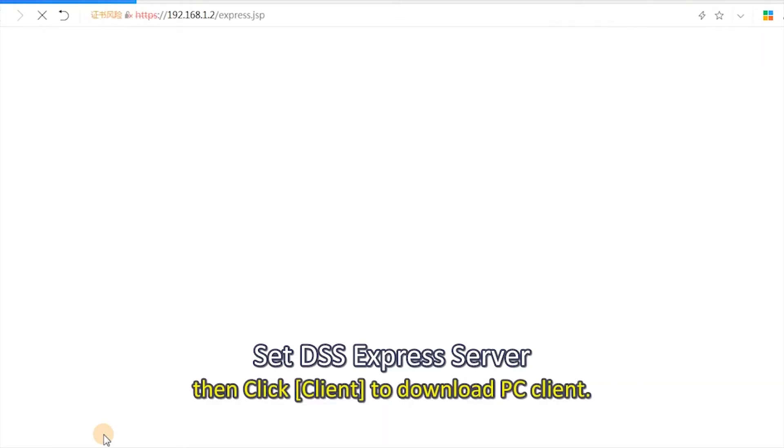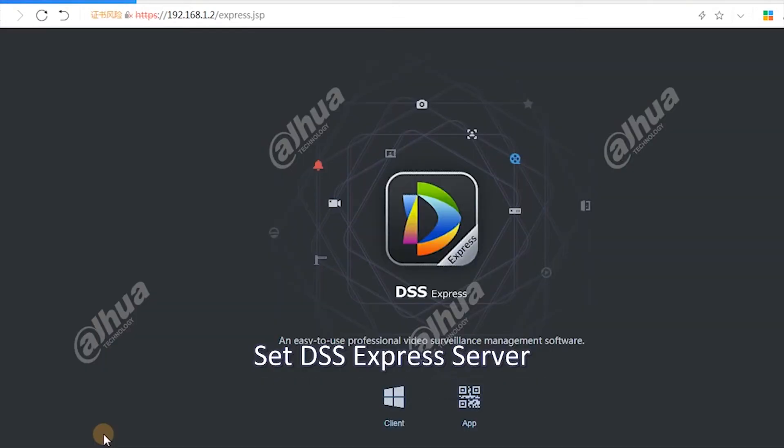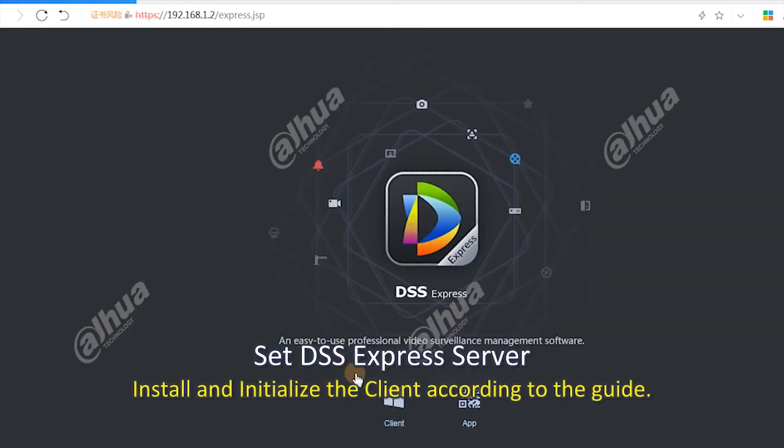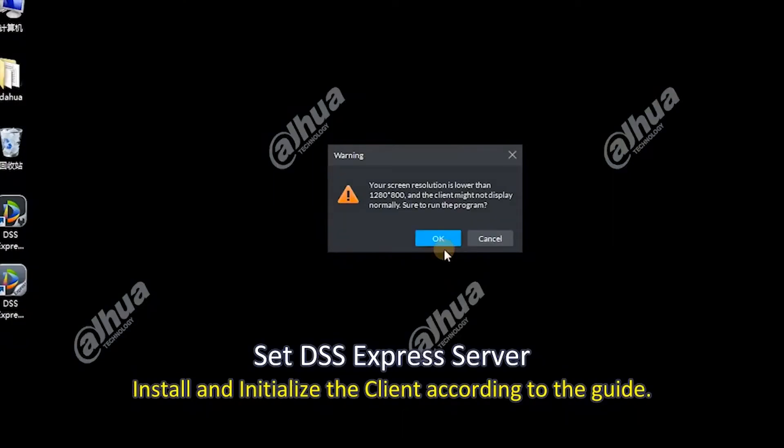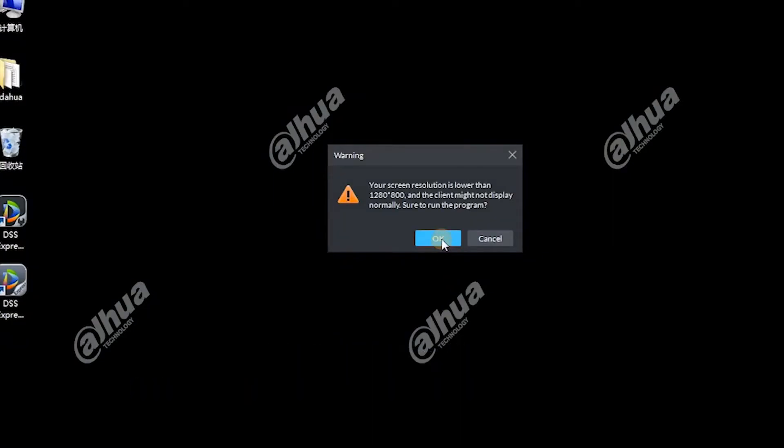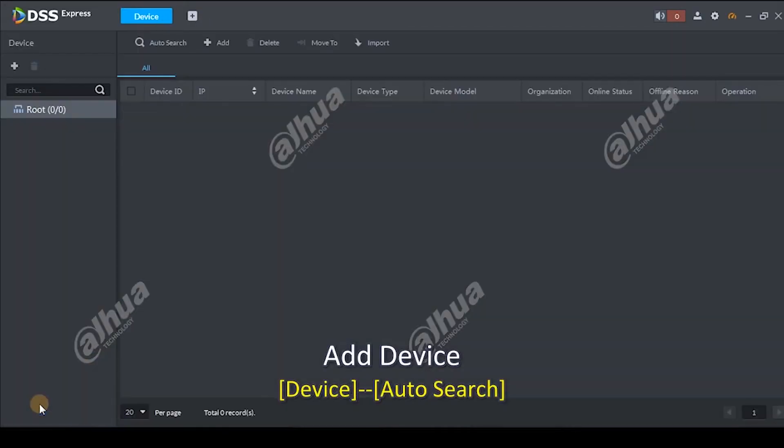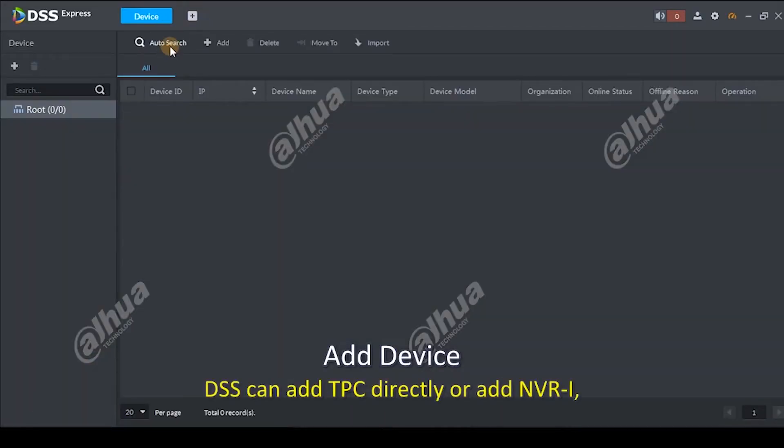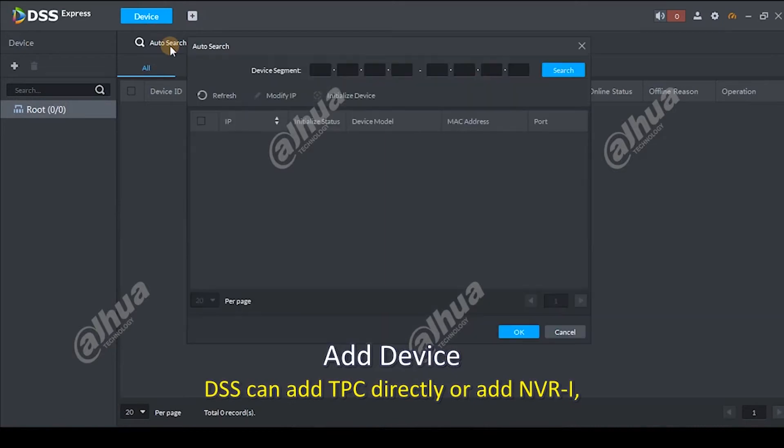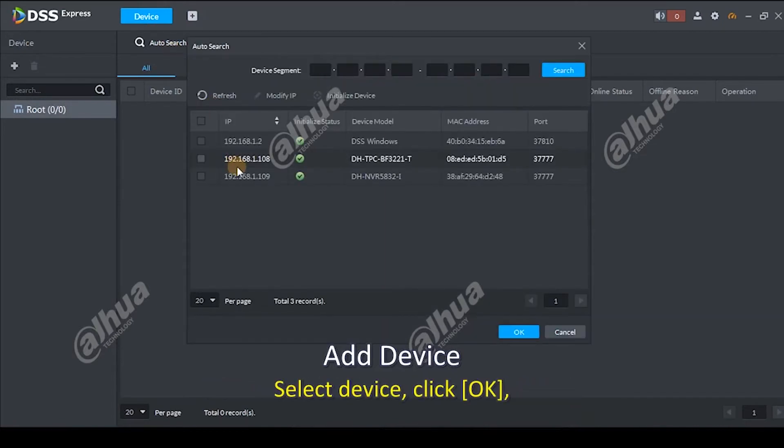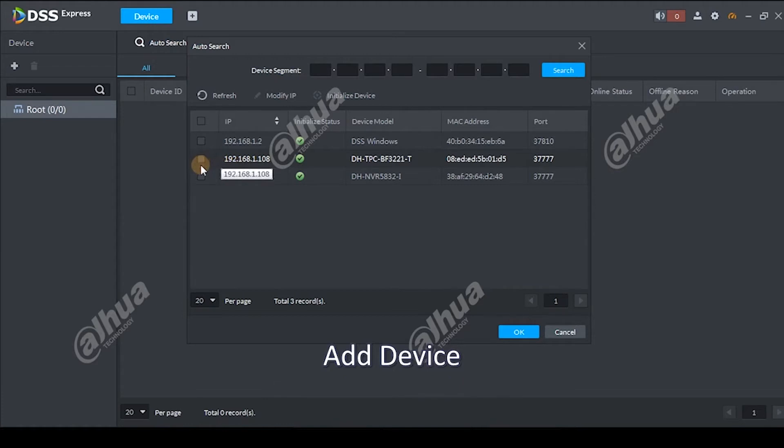Download PC client. Install and initialize the client according to the guide. Add device. Device auto-search. DSS can add TPC directly or add NVR-I. Select device, click OK.